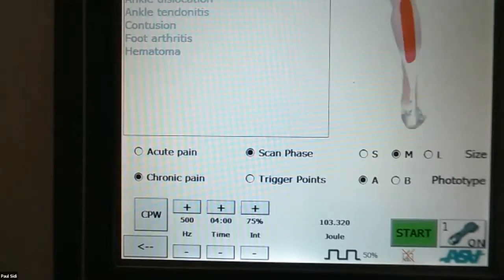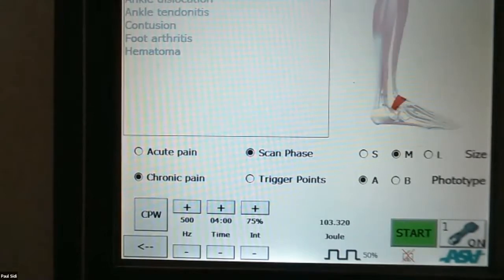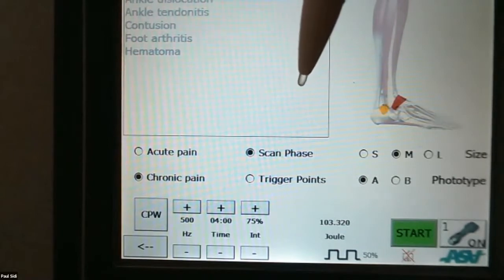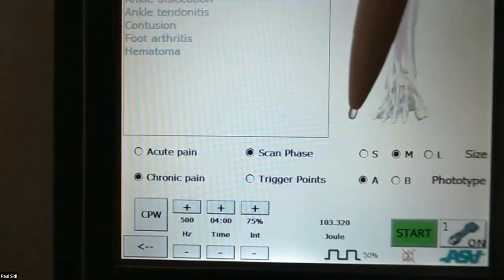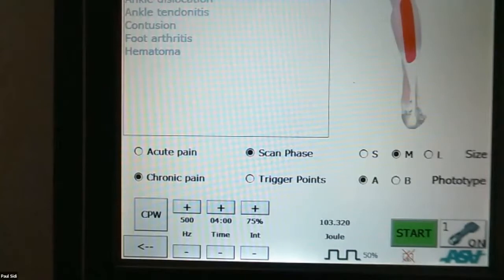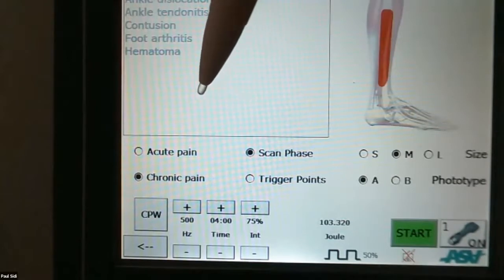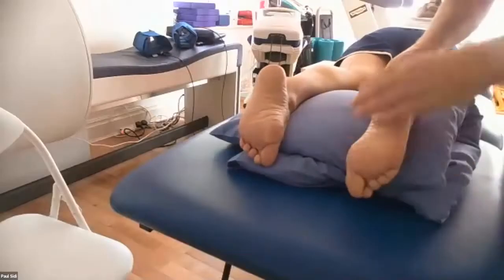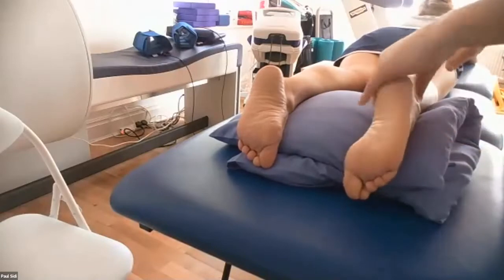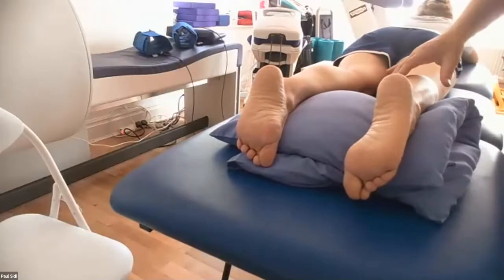One thing, I know we want to be a bit quicker than we normally are, but one thing which I always have to mention is we've done, let's say, the scan, then we've done the pathology. Trigger points, big problem with trigger points causing problems in the foot. Medial head of the gastroc will often cause problems down to that arch area and probably down to the first MTP. So what we do is we look for the trigger points. Right, we're going to check the trigger points everywhere. Anything up here? Got a big problem just here. And the medial head of the gastroc is actually even jumping there.